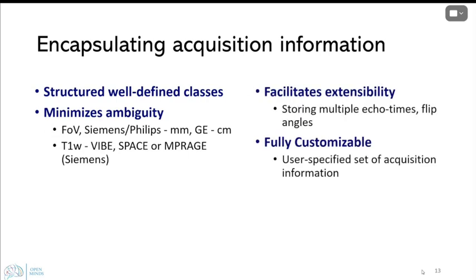MRdataset is also very extensible and customizable. It gives full control to the user by allowing different kinds of studies. If the sequence has a particular design, it also allows us to capture multiple echo times for the same sequence and variable flip angles, and it can be tailored to your needs and preferences.